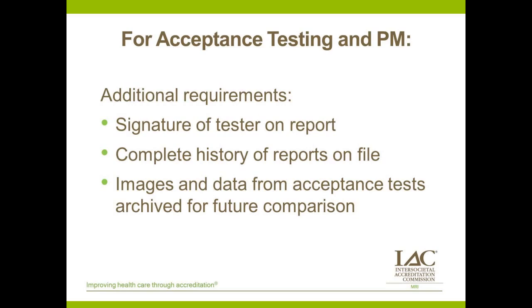And ideally, you need to maintain those images or the data from your acceptance tests. So all the scans that are done, phantom images, system measurements, system calibrations, reference data sets.